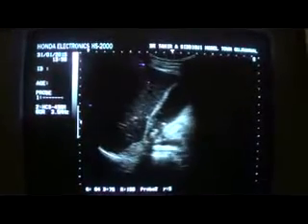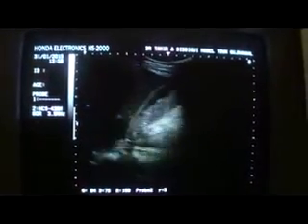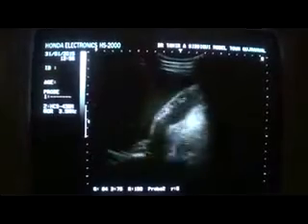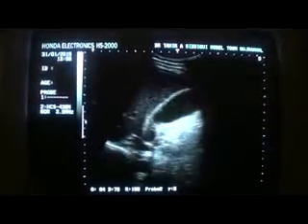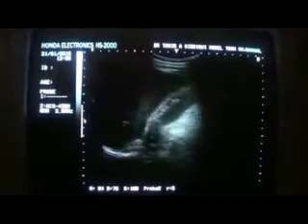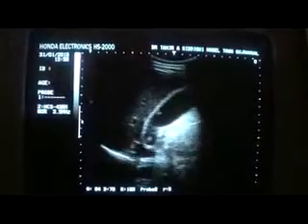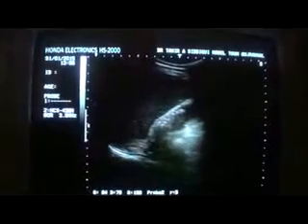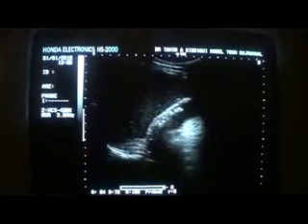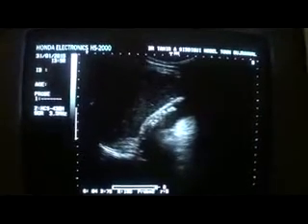So in supine posture, now I'm going at least one intercostal space down and going to ask the patient to take a deep breath and hold it. Take a long breath and hold it. I don't see any significant change. Okay.